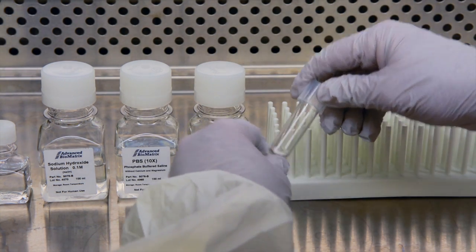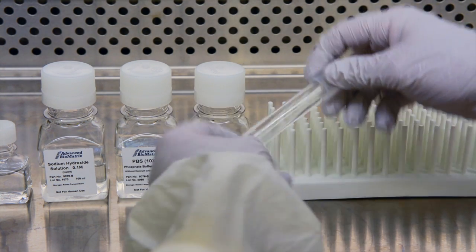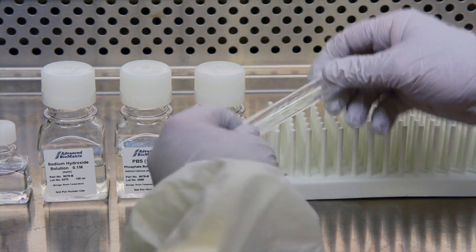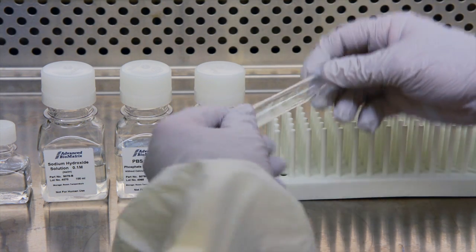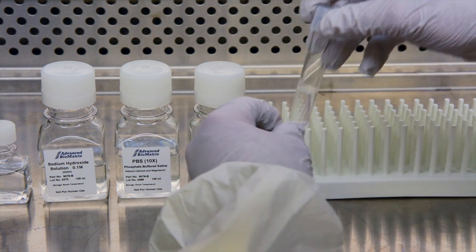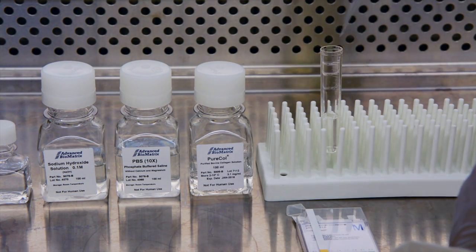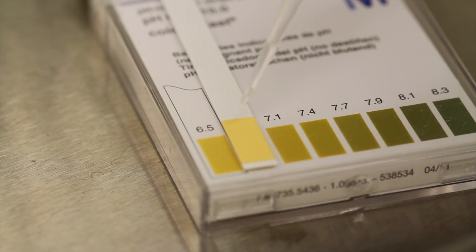To achieve a pH of 7 to 7.4, the volume of sodium hydroxide may need to be adjusted. Immediately cap the test tube and gently mix. Test the pH of the collagen mixture using a pH meter or pH strip to ensure that a pH of 7 to 7.4 is achieved.